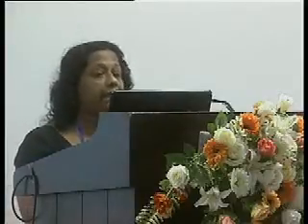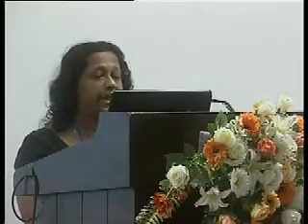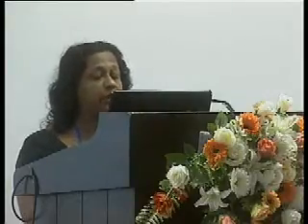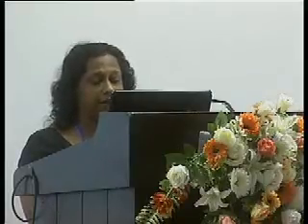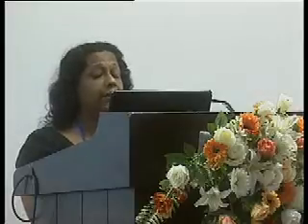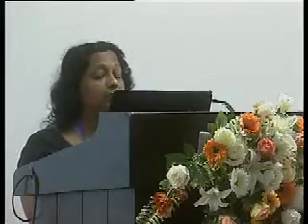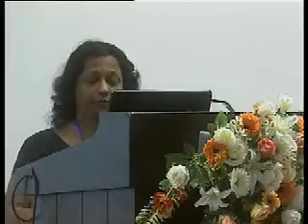Study design and methodology. This study was designed as an experimental analysis with a convenient sample. The patient number is 20, attending the diabetic clinic at the National Hospital Sri Lanka, selected to collect the 24 hour urine sample preserved with sodium azide. Patients with renal diseases other than diabetic nephropathy and pregnant women were excluded using the clinical history.